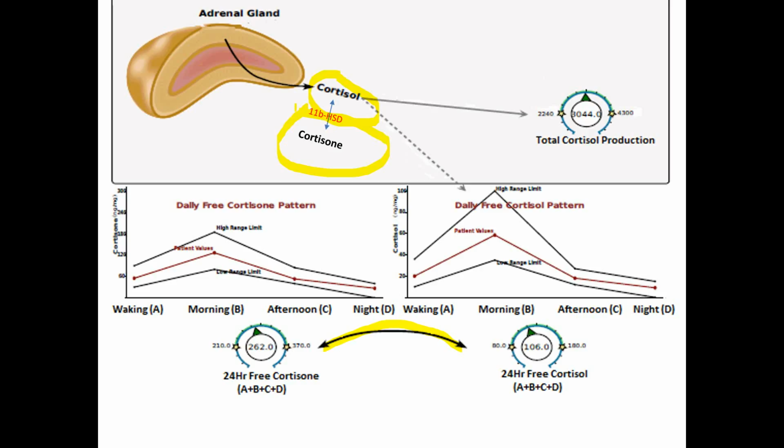So since cortisol circulates in both forms, you want to also take a glance at the cortisone pattern to see if it is confirming that story of cortisol. So primary importance is the cortisol pattern. Secondary and confirmatory job is for the cortisone pattern. And then both of those are then metabolized to cortisol and cortisone metabolites, which we call metabolized cortisol, which is again your marker for total cortisol production. And the difference between the two, if you will, in a relative sense, infers something about metabolism.